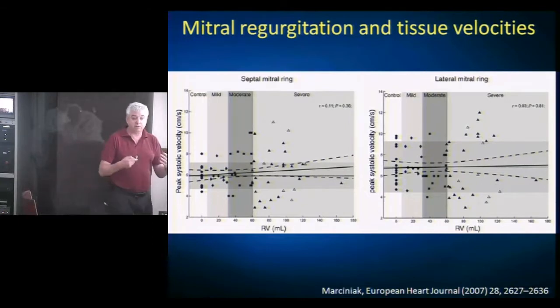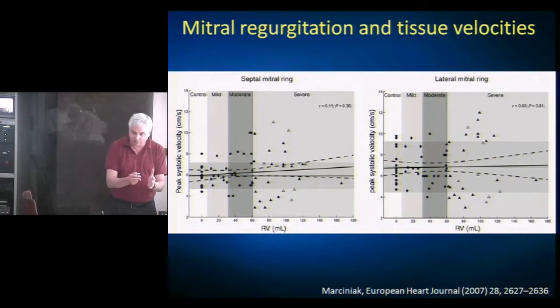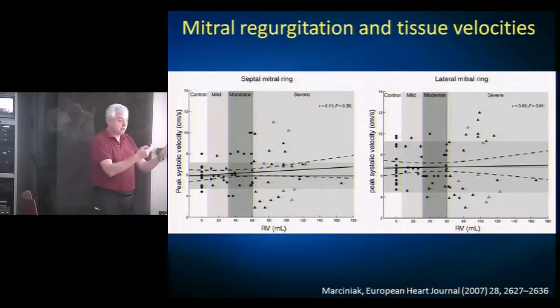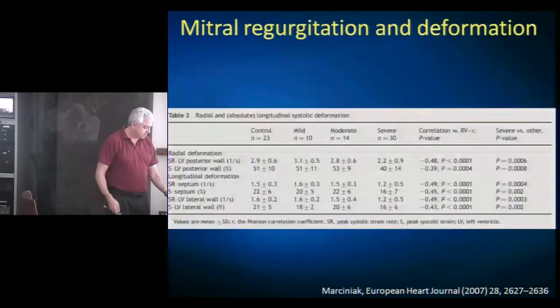And it's very difficult to judge what is a volume effect, because you're with velocities, what's the volume effect, and what's truly a reduction in contractility. Because just like we spoke for yesterday, for the aortic regurgitation, you want to catch the ventricle and intervene at a time where you can reverse that vicious cycle of ventricular enlargement, increased wall stress, increased contractility, etc., and I'll show you that.